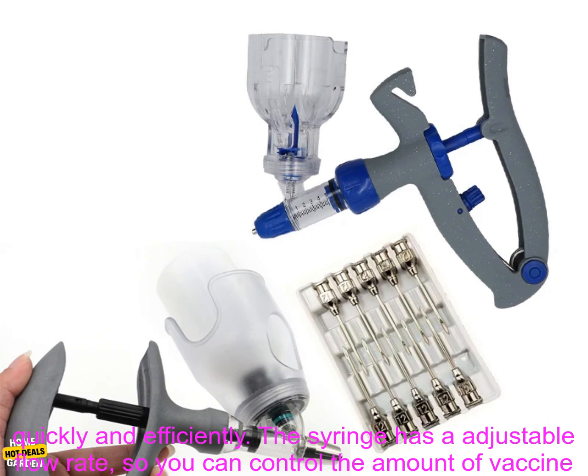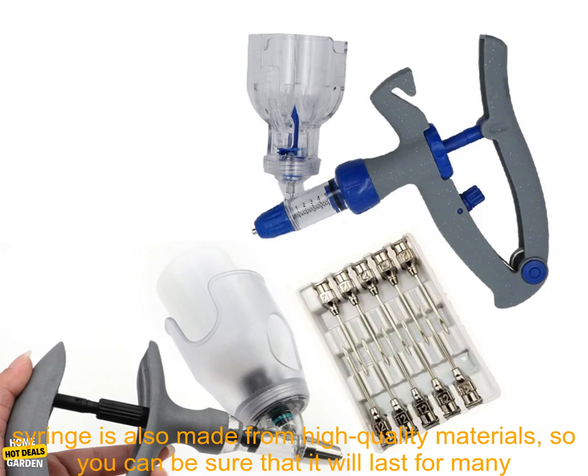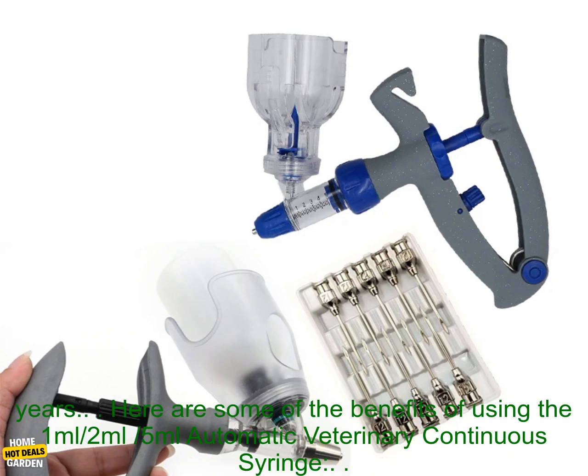It is easy to use and can help you to vaccinate your animals quickly and efficiently. The syringe has an adjustable flow rate, so you can control the amount of vaccine that is administered. This is important for ensuring that your animals receive the correct dose of vaccine. The syringe is also made from high quality materials, so you can be sure that it will last for many years.